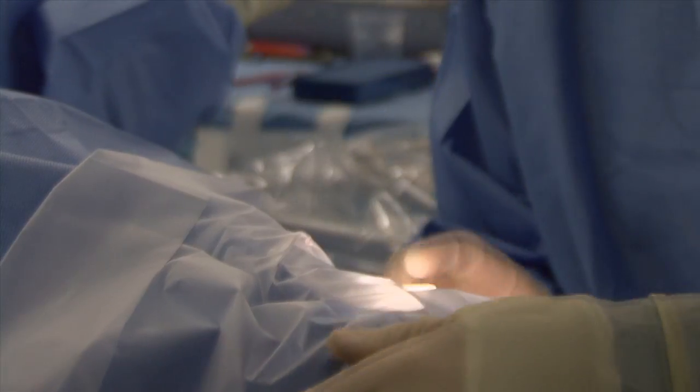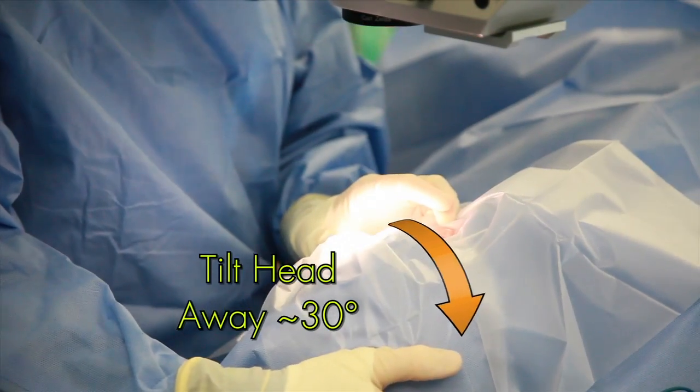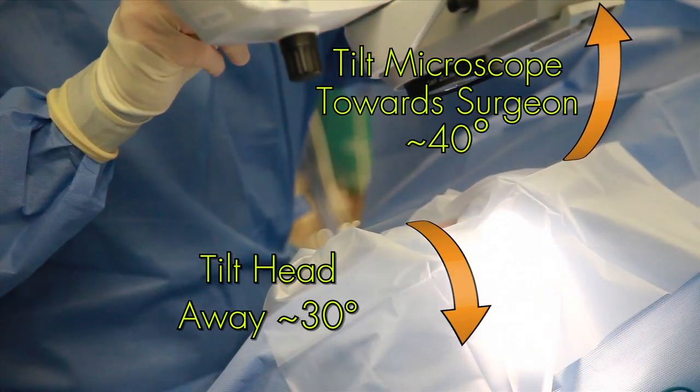I think the key early on is getting positioning down. It's amazing how much further you have to rotate the head away from you and tilt the scope away from the patient than you would imagine. So I believe getting the positioning down, the view down early, even before attempting your first trabectome, is key.